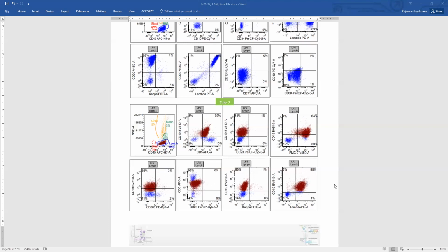So they might say mantle cell lymphoma, but usually for mantle cell lymphoma, you need a cyclin D1 or SOX11 positive result or a positive FISH finding. So we prefer to call it CD5 positive B cell lymphoma, and then put in the comment that the phenotype does not appear to be like a CLL/SLL.